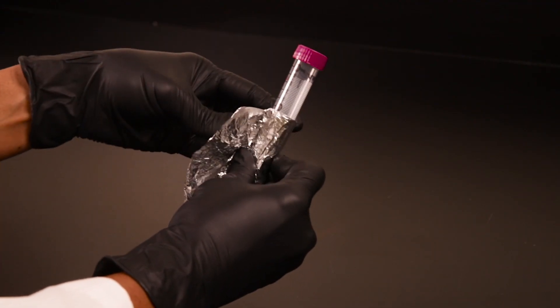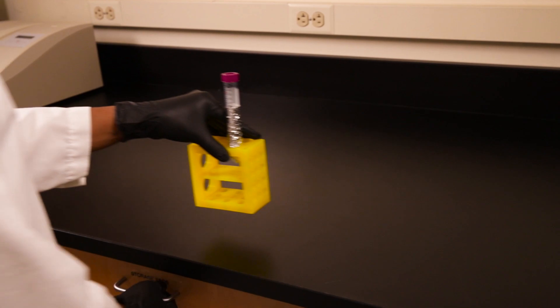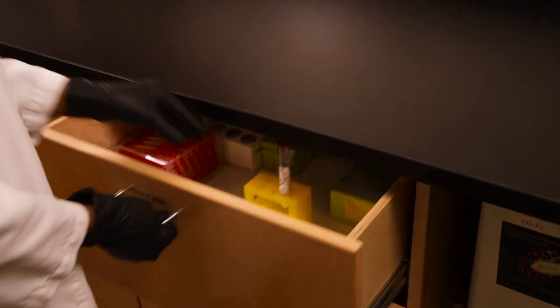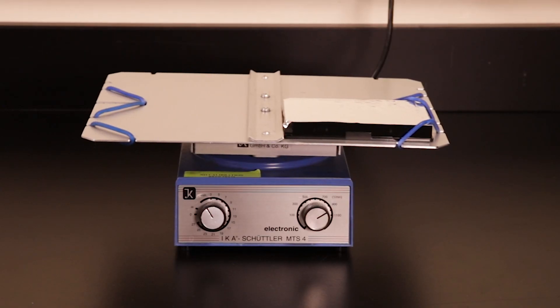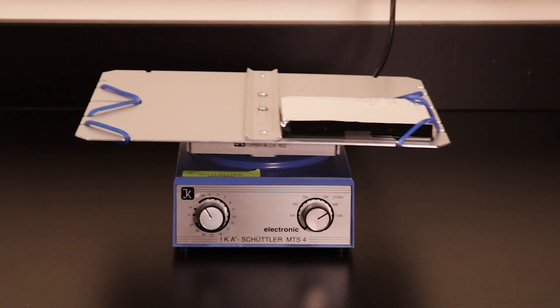To protect the diluted beads, wrap tubes in foil or store in a drawer until they are ready to use. Cover the plate with foil during shaking steps to protect the beads from light.